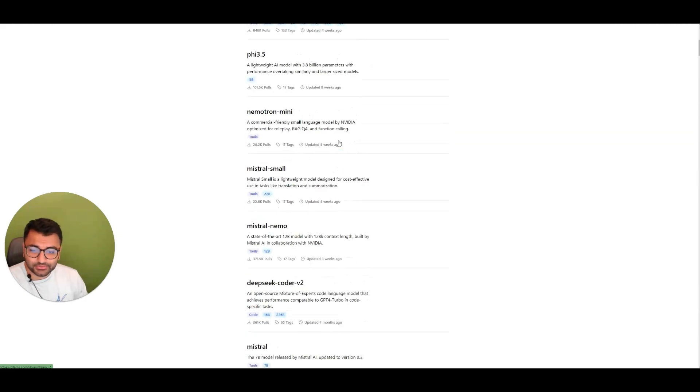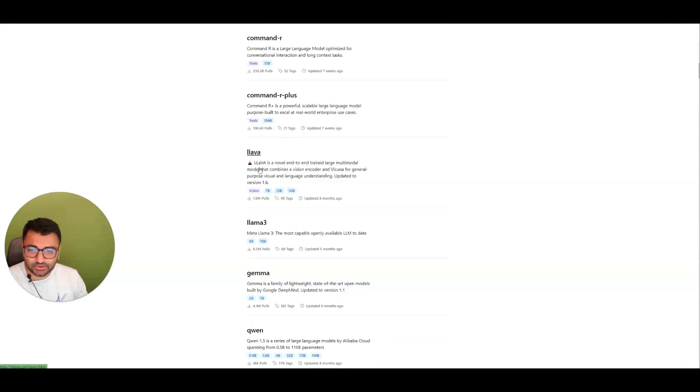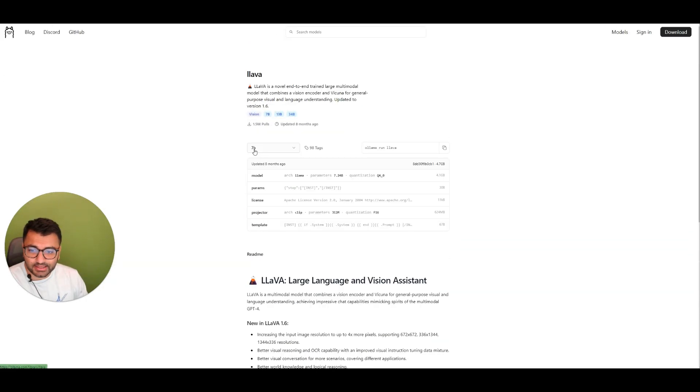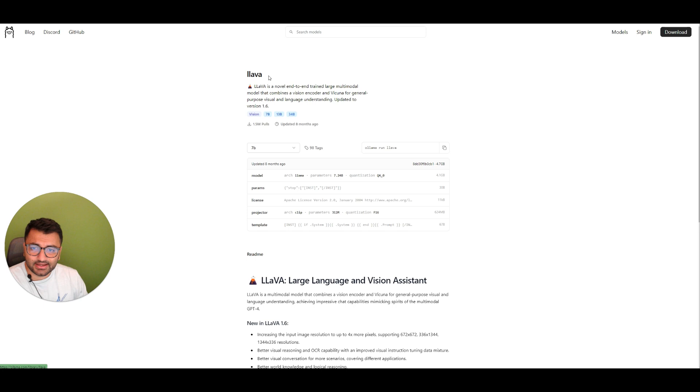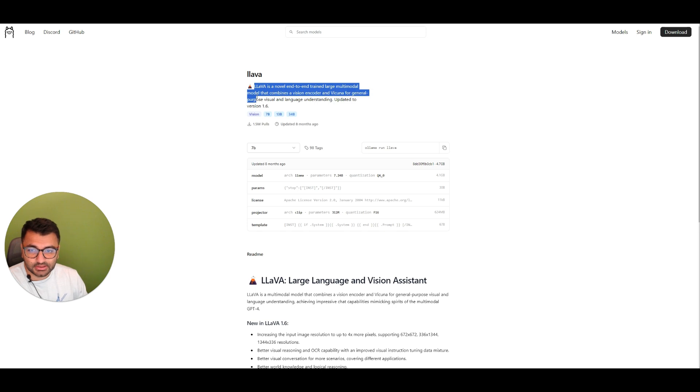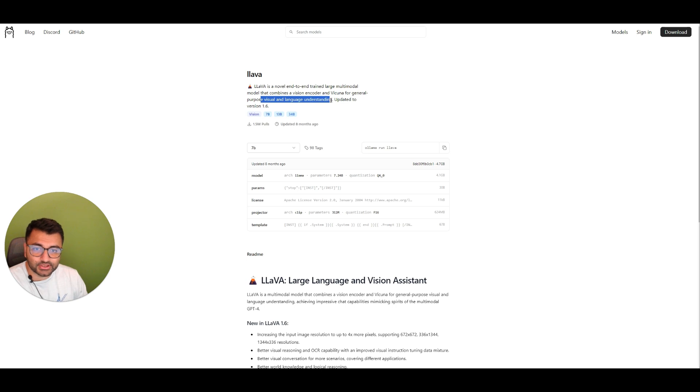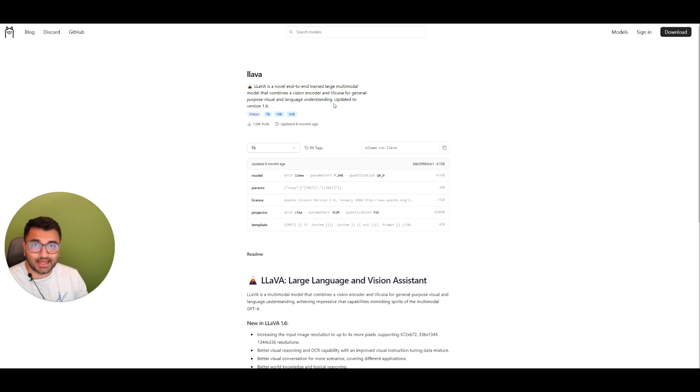So what I would do here is I'm going to scroll down and you can see that I have access to Lava. And Lava is a novel end-to-end trained large multimodal model. So it combines a vision encoder and Vicuna for general purpose visual and language understanding. So that's perfect. That's exactly what we want.